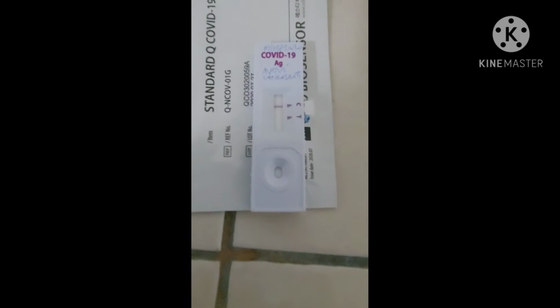Now there are 2 ways to interpret this result, which is different from the rapid antibody testing, which has 3 possible lines. In this case we have a C and a T. Now the C is the control. As usual, it shows that the test is functioning, that the sample that was taken is adequate, and that it is a correct test, right?